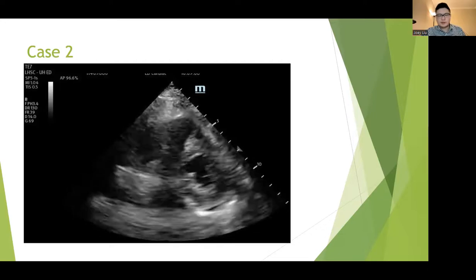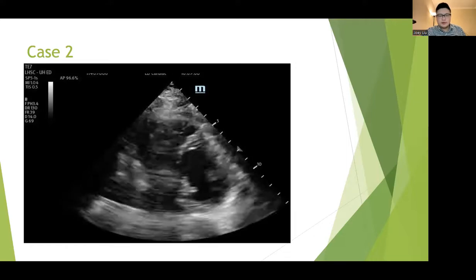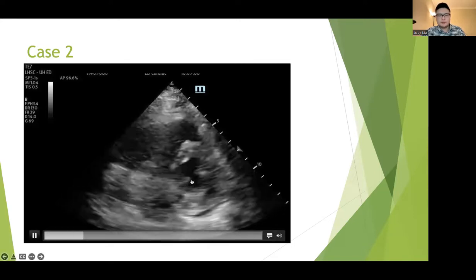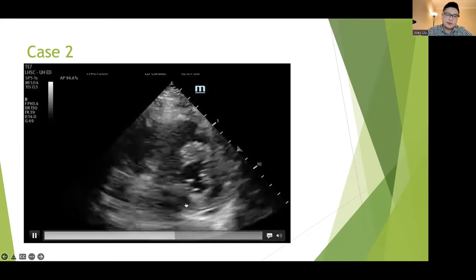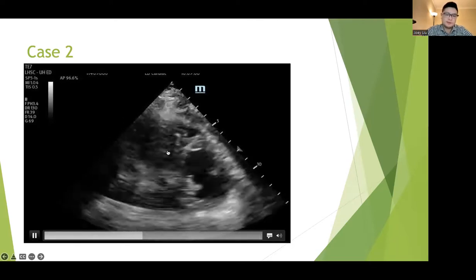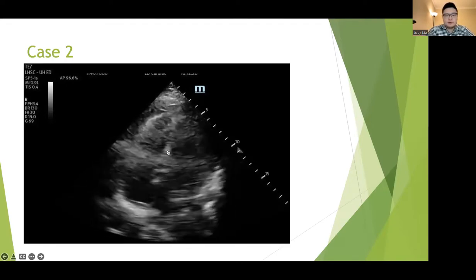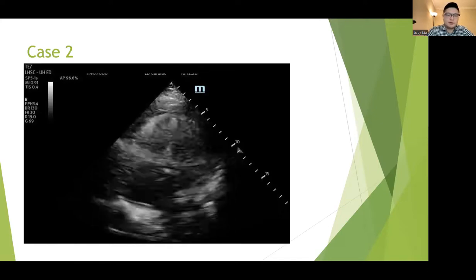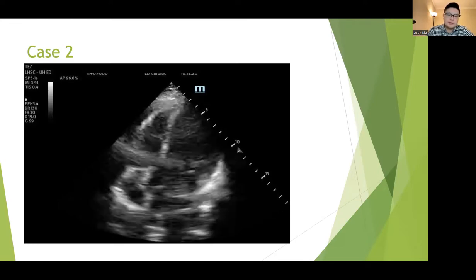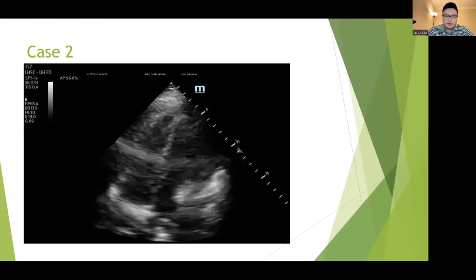And in the parasternal short axis view here, you can see that the LV again is contracting quite well, emptying a good amount of volume with each contraction. But we were wondering about whether or not there could be a bit of RV dilatation from this view, but maybe it was just the way that I was slicing the image. Going to the apical 4-chamber view, from a size standpoint, the RV itself does not look to be more than 2/3 the size of the LV. So from this, we said, okay, the RV size is probably closer to normal as well.